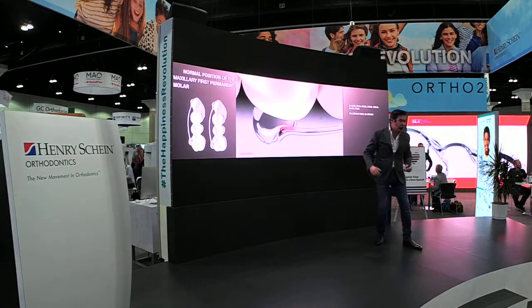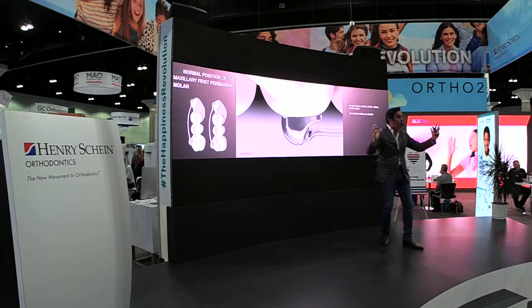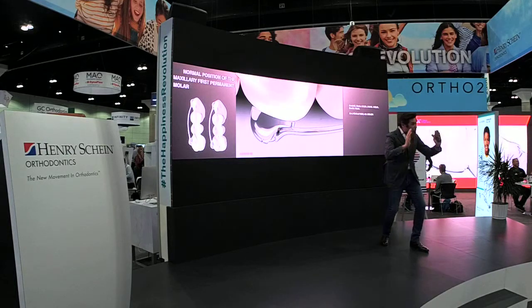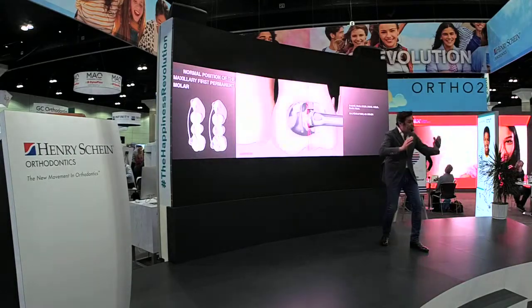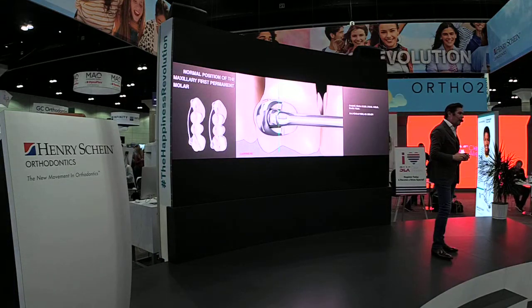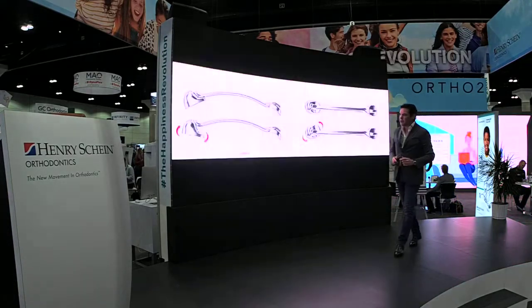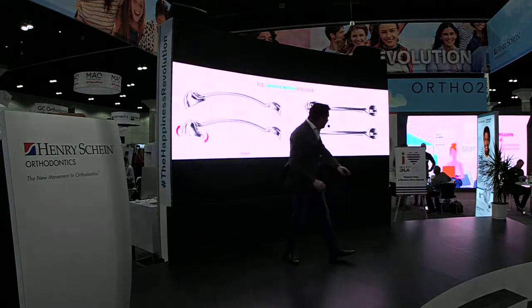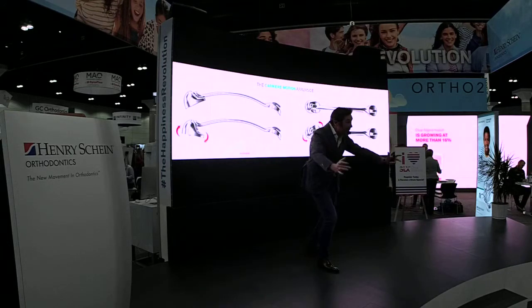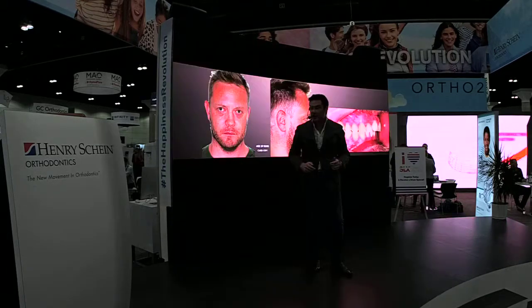The motion appliance is going to rotate the molars around the palatal root. It's going to accomplish a correct rotation of the molars. It's going to upright those molars, and it's going to protect them so that they are not tipped, because self-engineered collision points in the design of the appliance have been establishing a nice relation between these structures. So this appliance has the capacity of uprighting, of rotating, and at the same time moving the posterior segments in a block in a perfect occlusion in class 1.